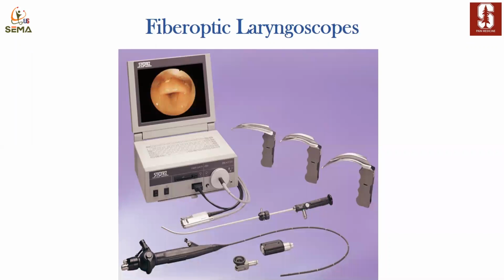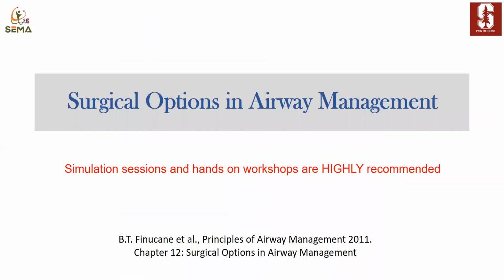and for the fiber optic, as an anesthesia provider, most of us like to use the flexible fiber optic. The rigid is mainly used by ENT, but you may need to use it at some point. But I'm very confident that you can do almost everything with a flexible one if you know how to use it.